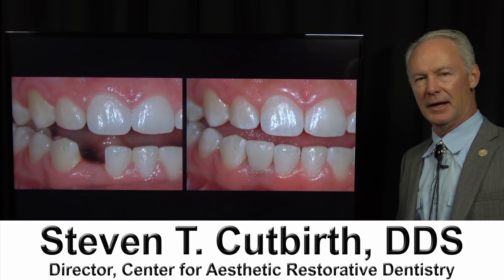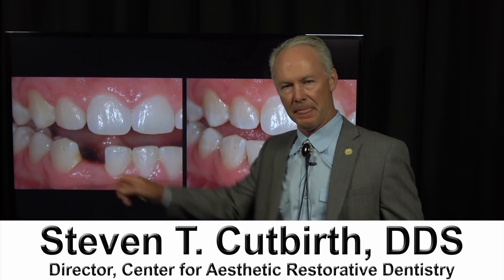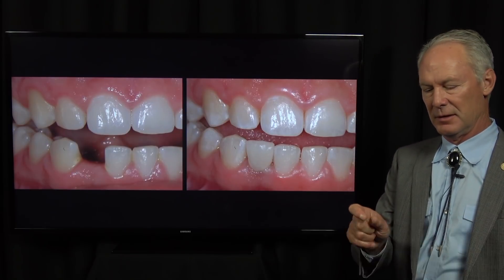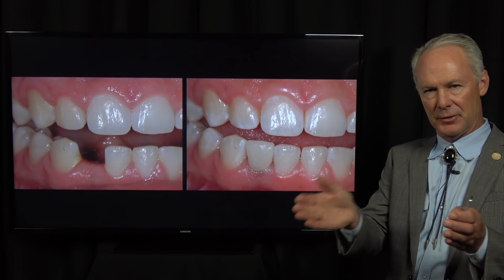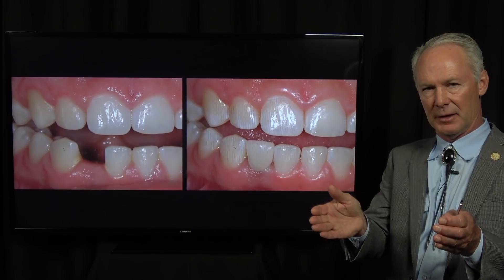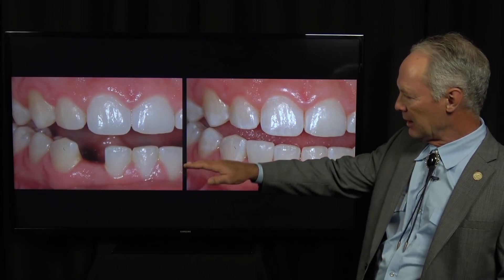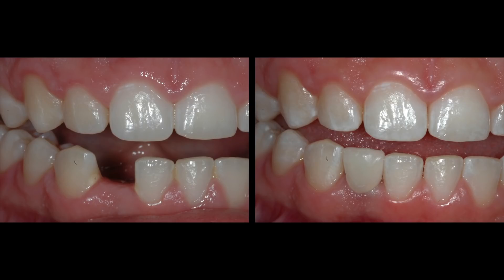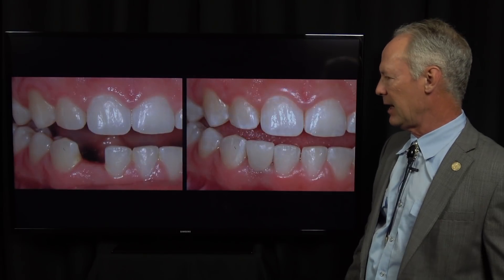How do you restore this edentulous space? You've got a thin alveolar ridge faciolingually, but you've got a normal alveolar crest. This is a congenitally missing lower lateral incisor. What are your restorative options?